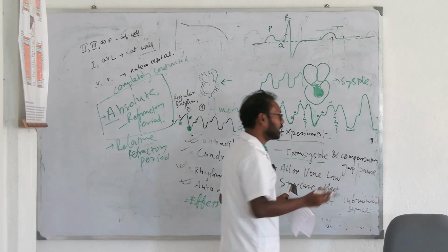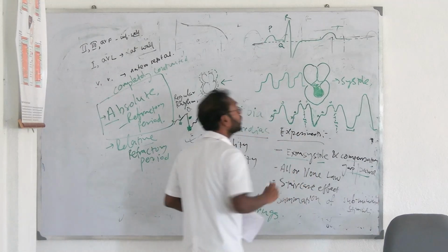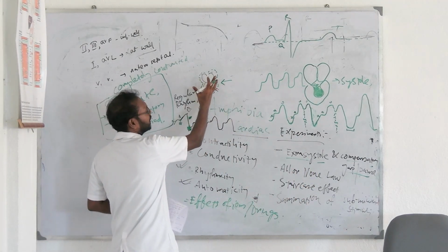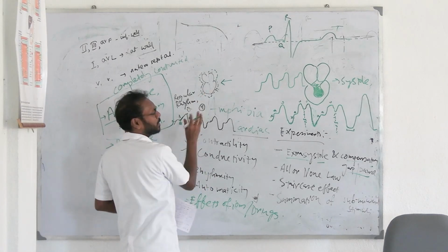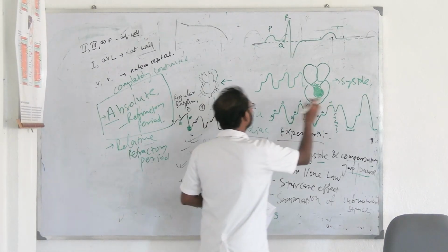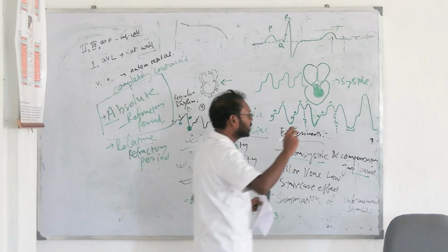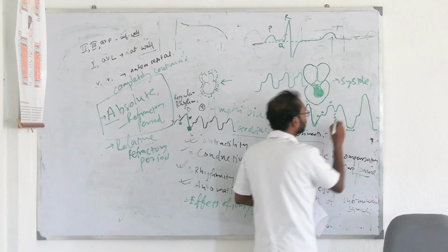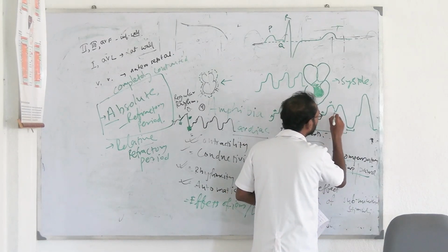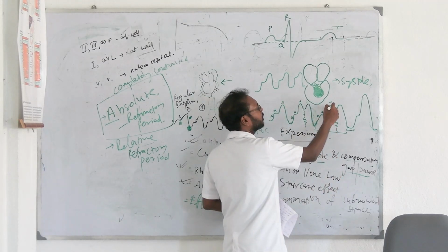Now you will have your question about now why this gap, why this compensatory gap or compensatory pause, because আমার হার্ট ও ডায়াস্টল হচ্ছিল, ঠিক আছে, I again provided outside stimuli, so it gets contracted again, now again it dilates. So the dilation happens during a longer duration. So this dilation এখান থেকে শুরু হয়েছিল, এখানে contraction complete হয়ে গেছে.